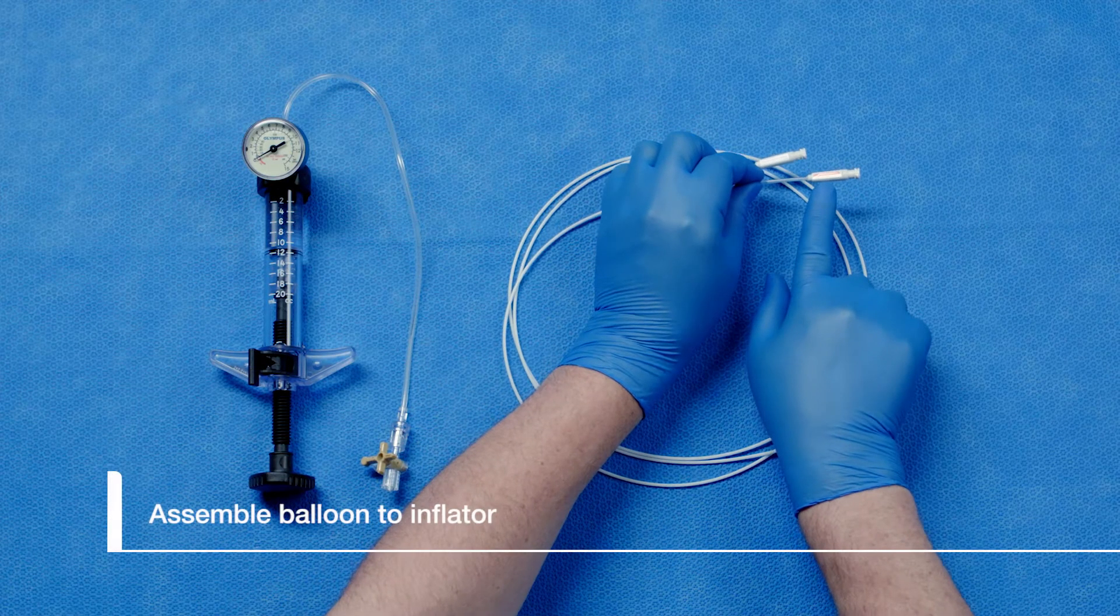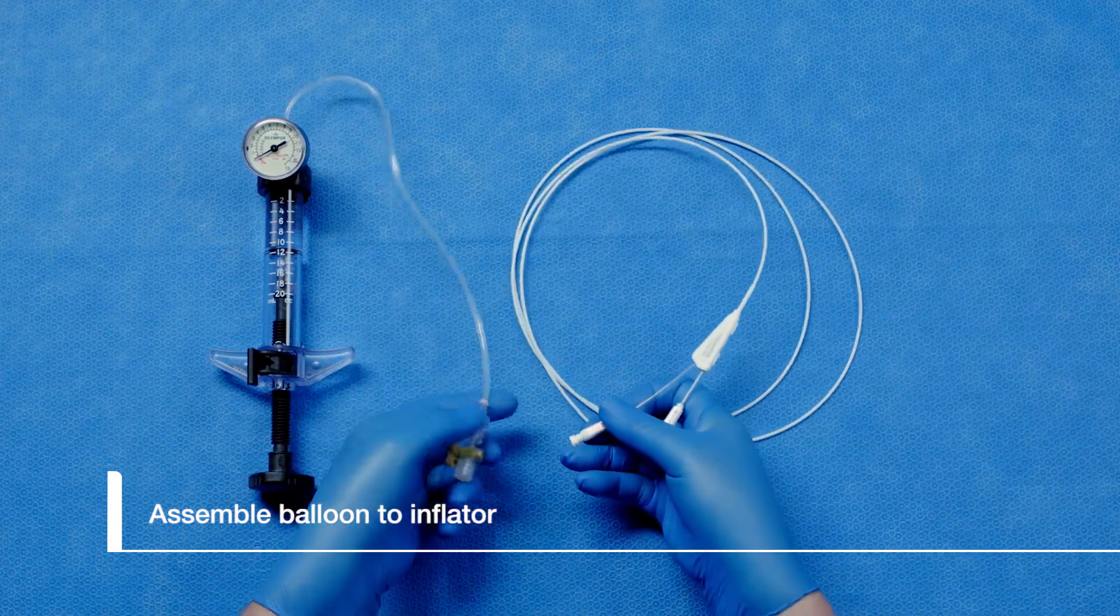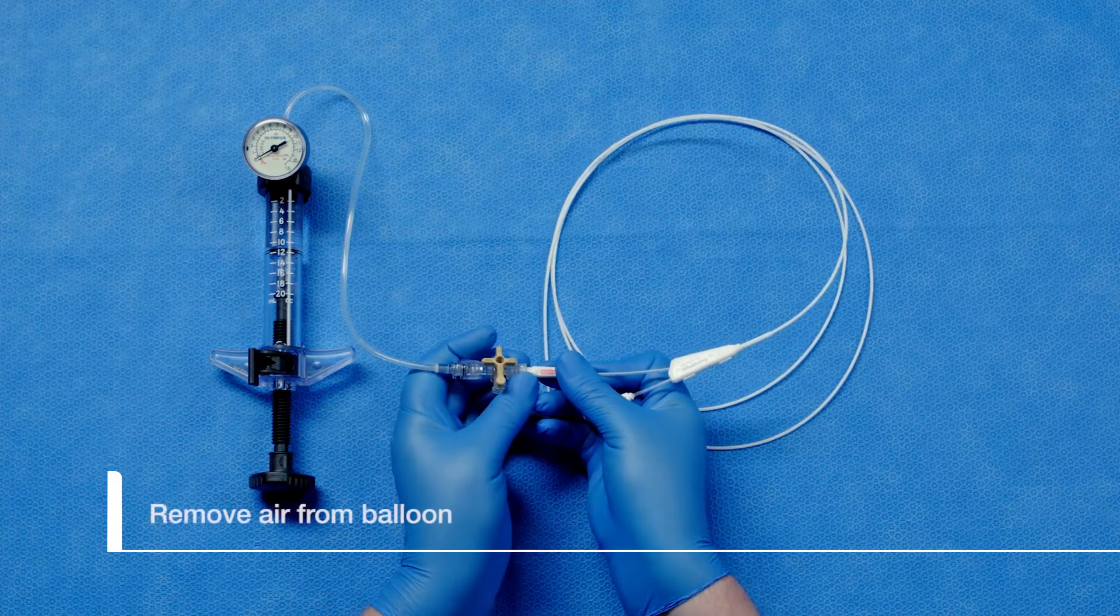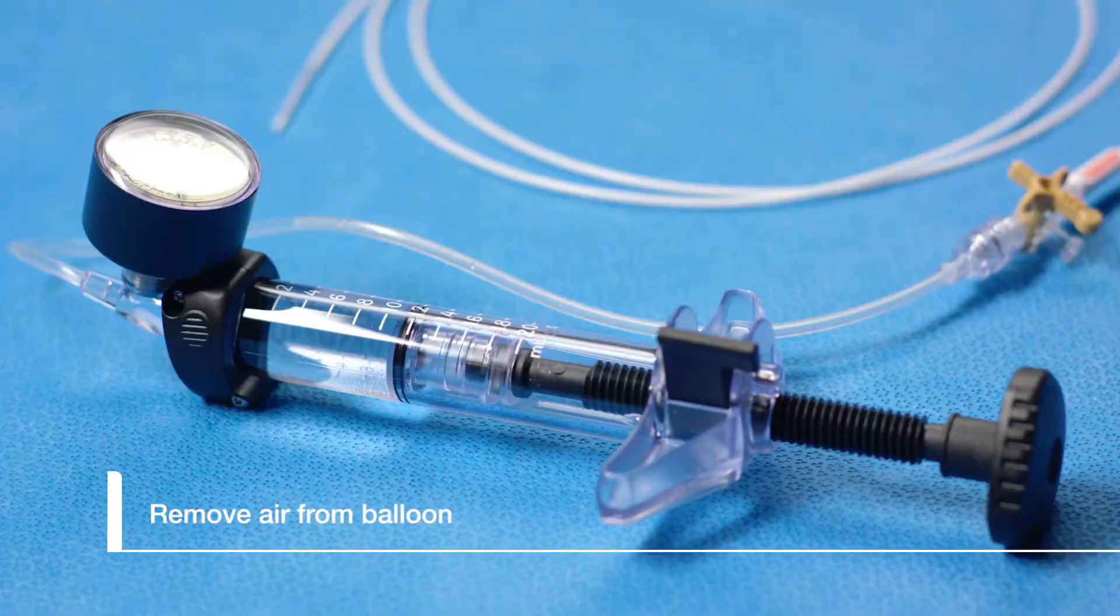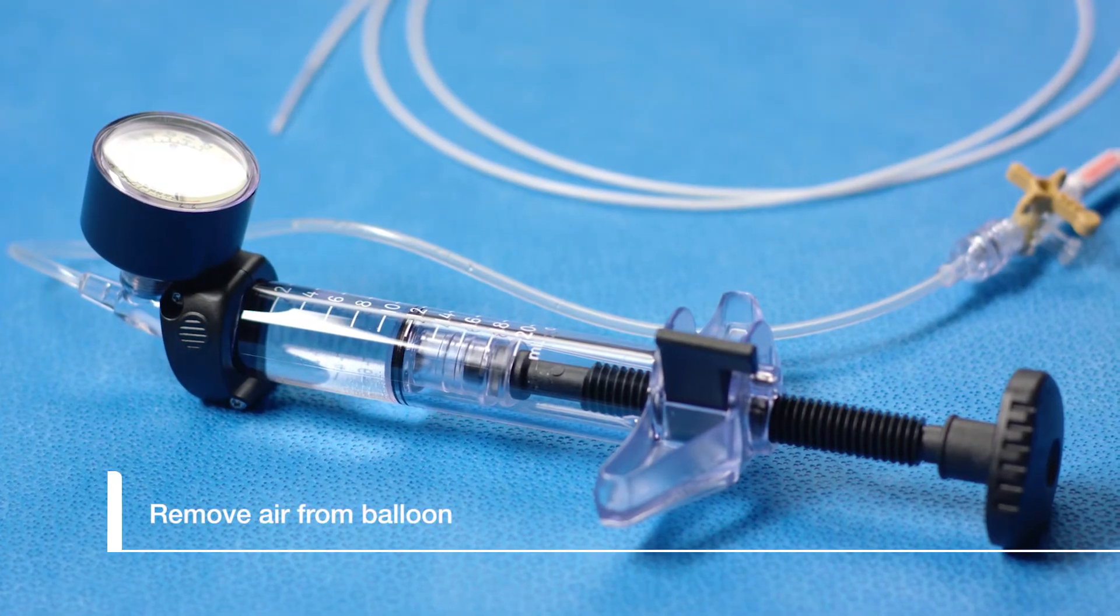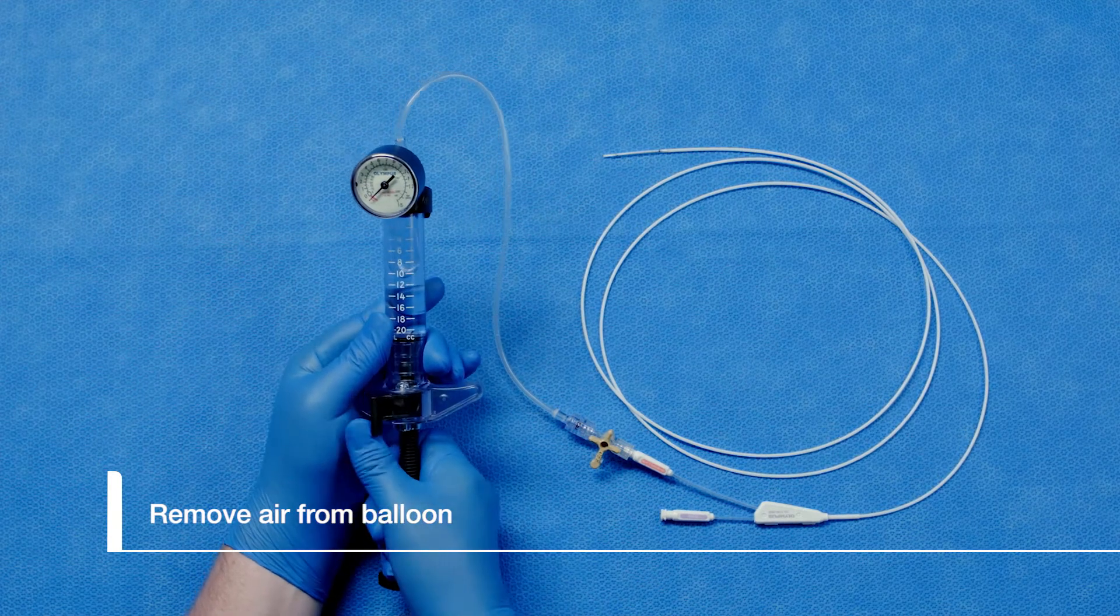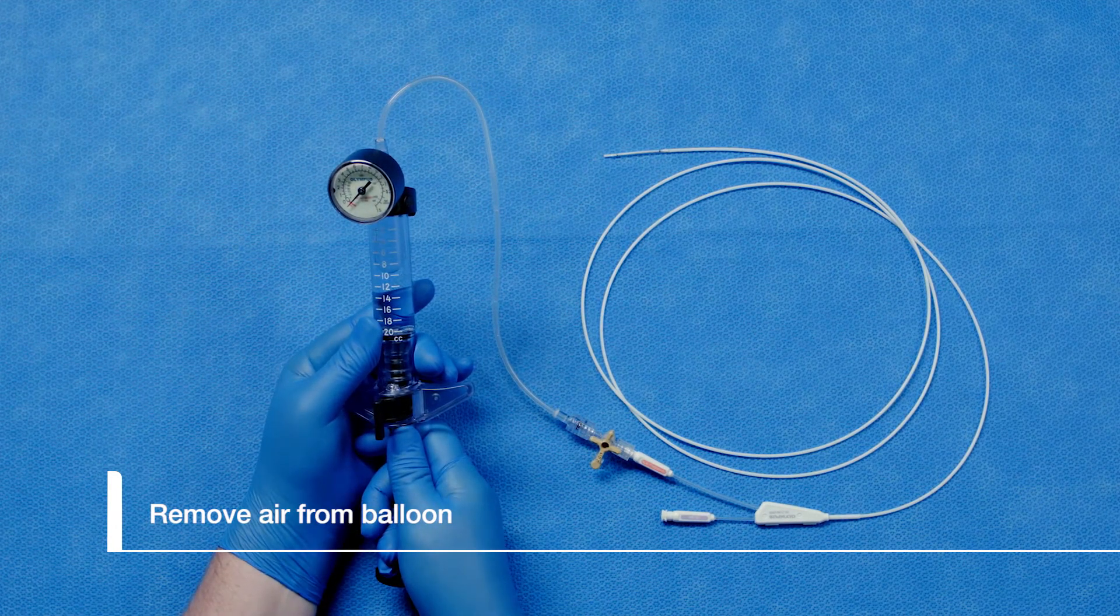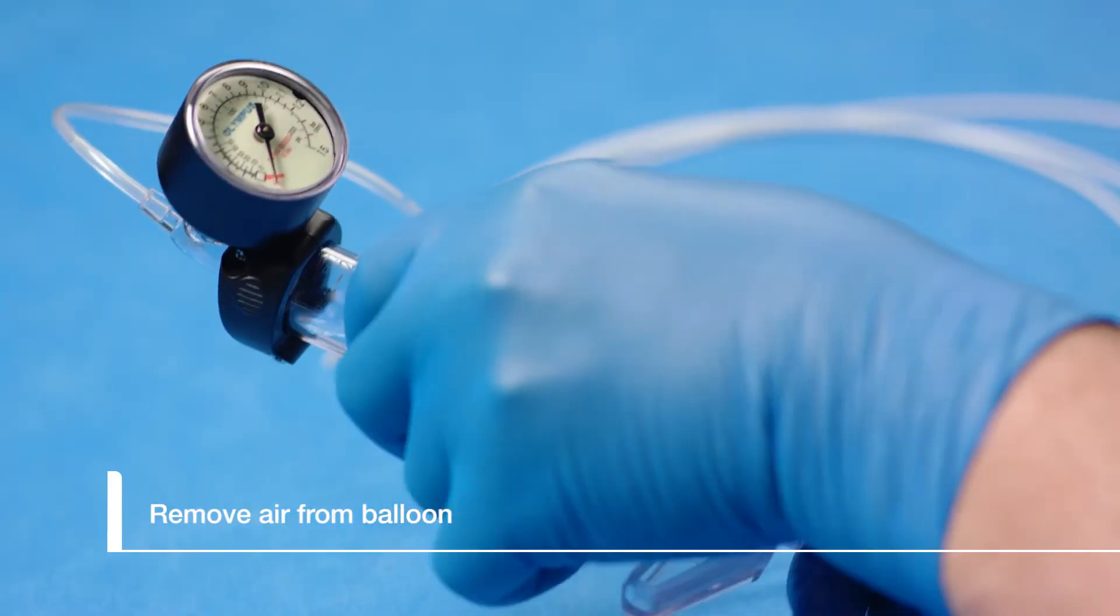Next, thread the balloon port on the balloon catheter to the inflator T-piece on the inflator catheter. In order to properly inflate the balloon, we need to remove all of the air from the balloon catheter. To do this, we will pull the plunger all the way back and lock the switch to the center position. Notice the air from the balloon has been drawn into the inflator.